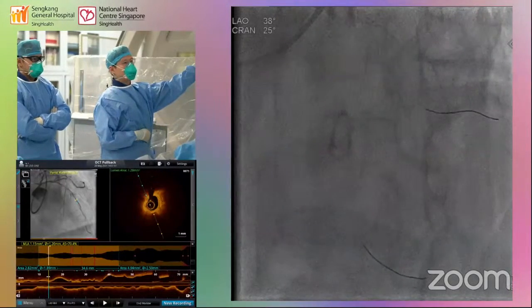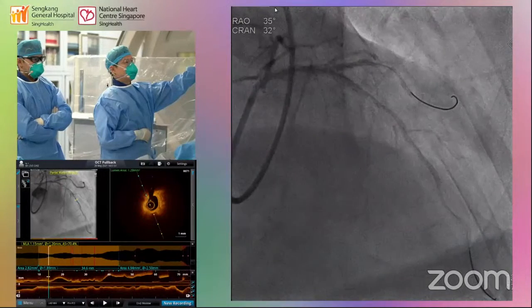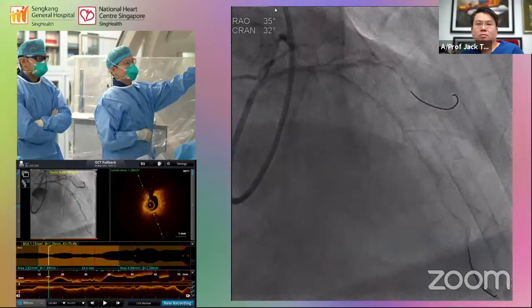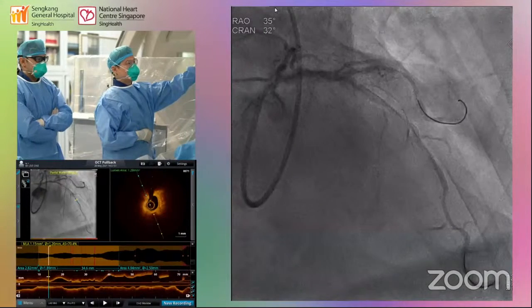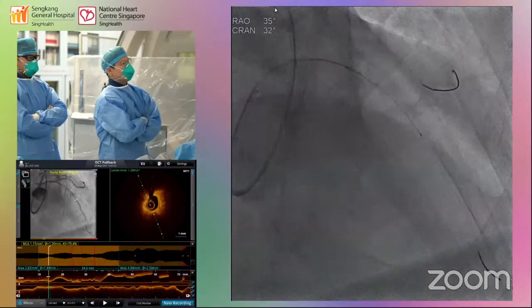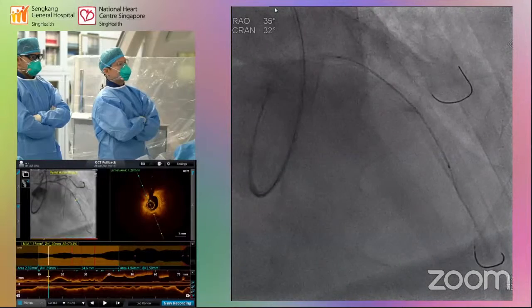All right. Next, this is the intracoronary nitro shot that I always administer before I pass the catheter down, to reduce the risk of vasospasm. This is the shot to show that I deliver down the OCT without pre-dilatation of the LAD. So it's highly deliverable.